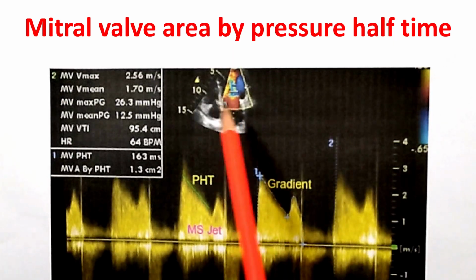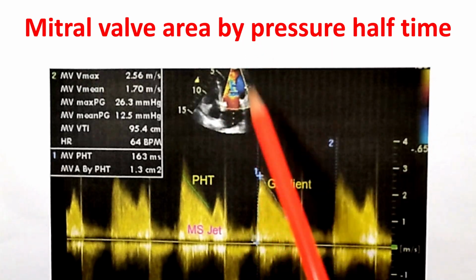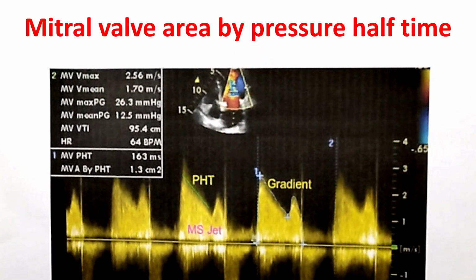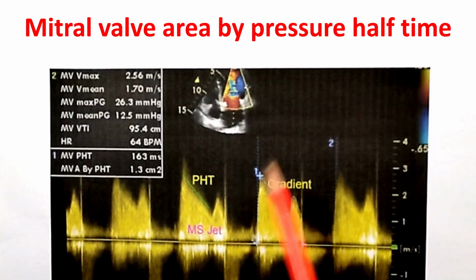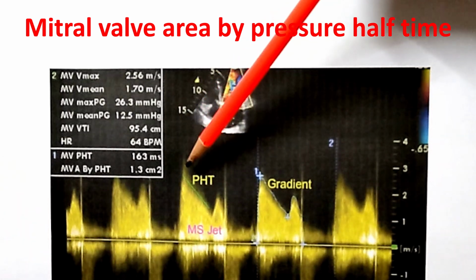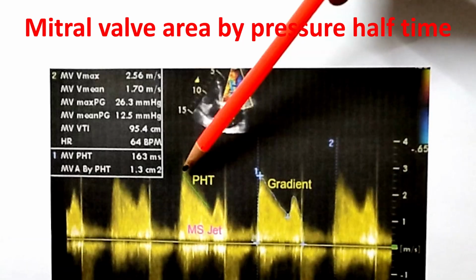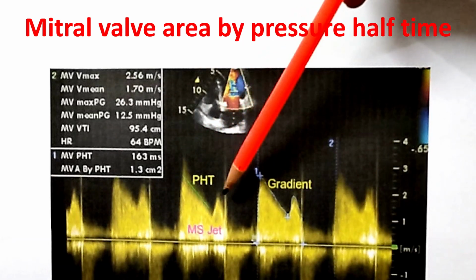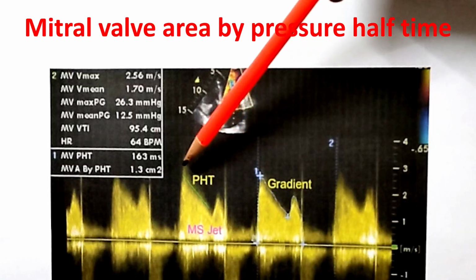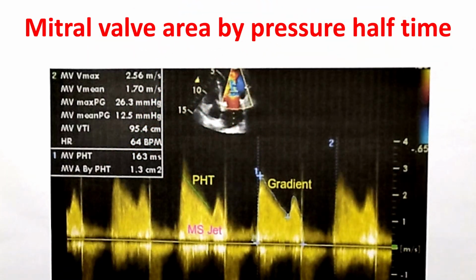This is measured in the apical 4-chamber view. You align the cursor along the good mitral jet and get a good Doppler tracing like this. And all you have to do is mark the slope, that is from the peak of the E wave. This is the mitral E wave and this is the atrial systolic A wave. Just mark the slope and the machine will calculate it.